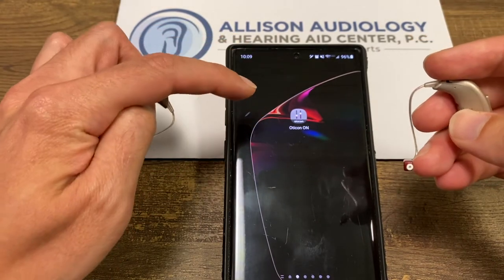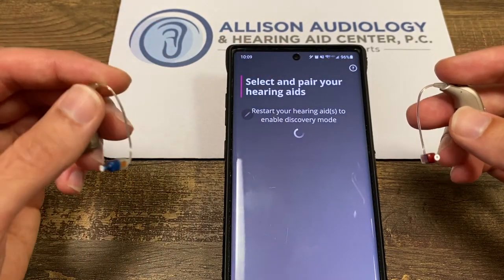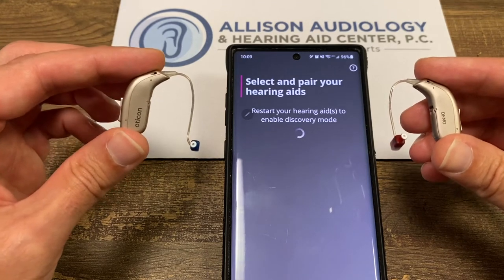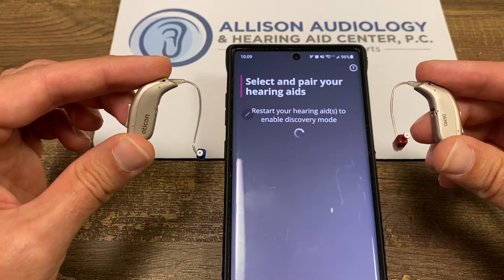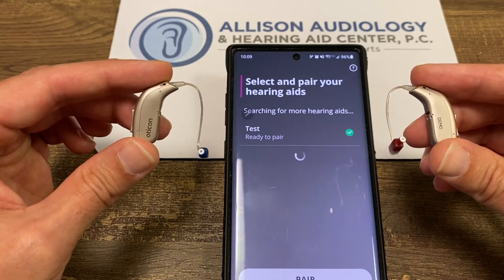Now we go to the Oticon app. It says to restart them — essentially that's just what we did. We turned them off and then turned them back on. In about 10 seconds or so, the hearing aids will pair to the phone.